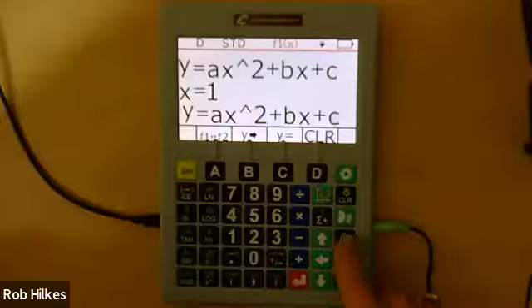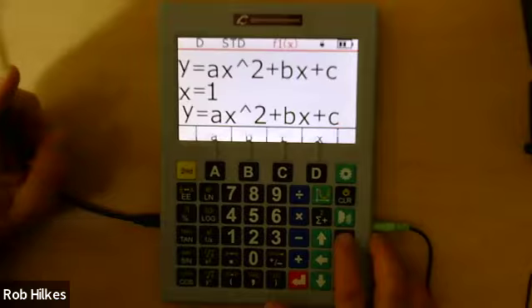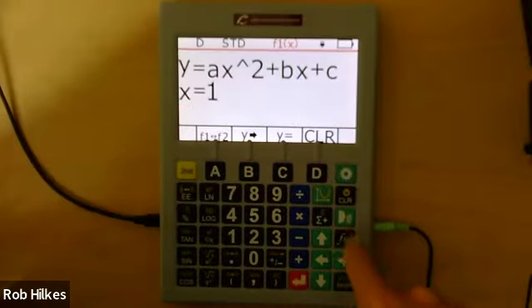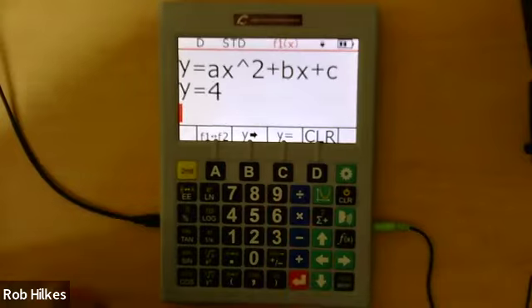Well, I'm confused because I'm trying to figure out what y is. That's funny. Now I'm embarrassed. Oh, there it is. I beg your pardon.